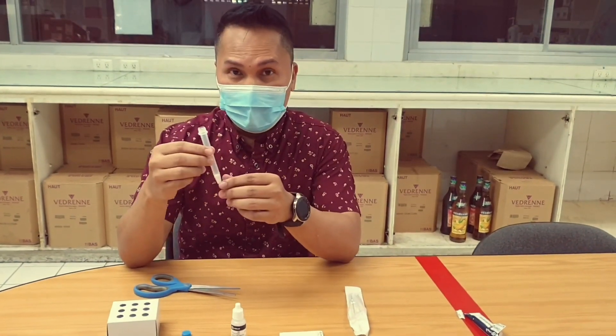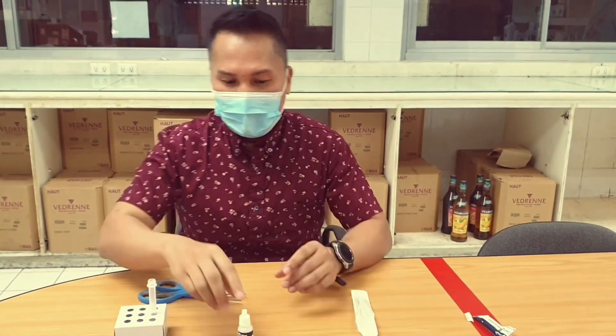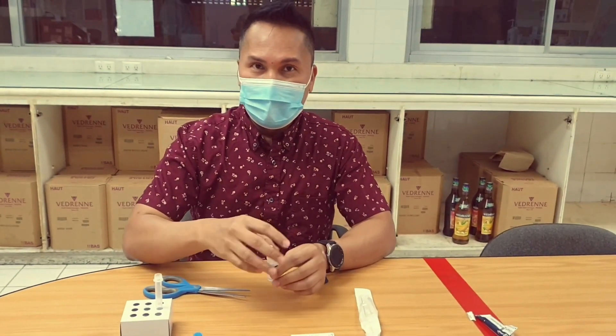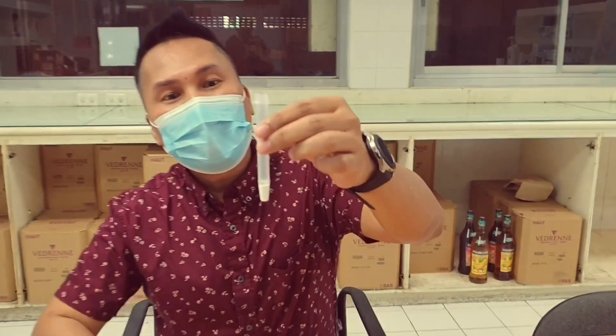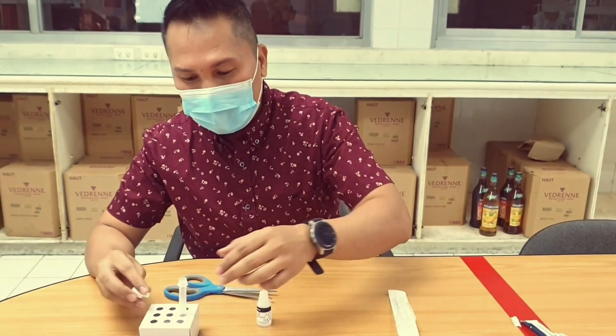Now I am going to put the collection tube here at the tube rack, and I need to put a few drops of rapid test device buffer first. The collection tube has a mark on it, which means you only need to fill it with the liquid up to that mark.